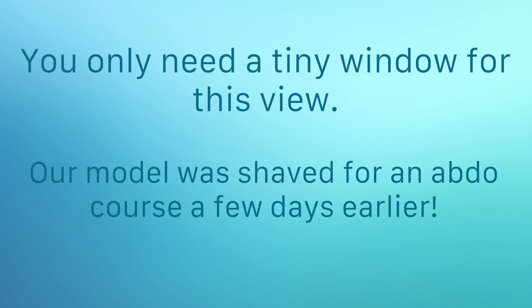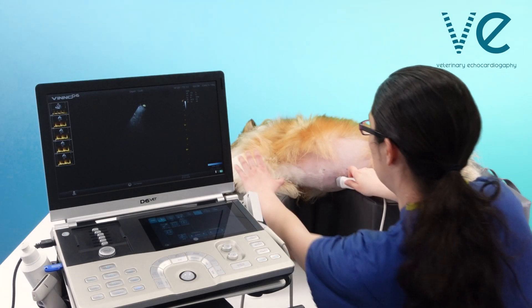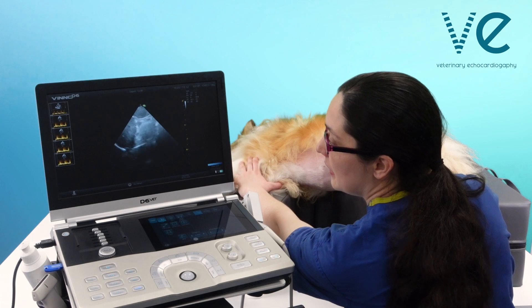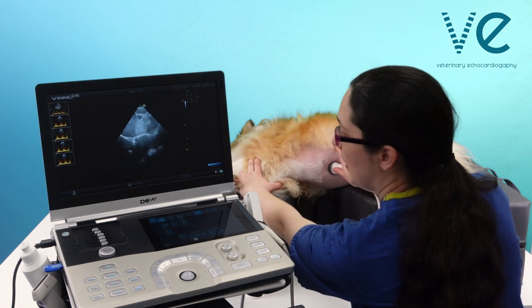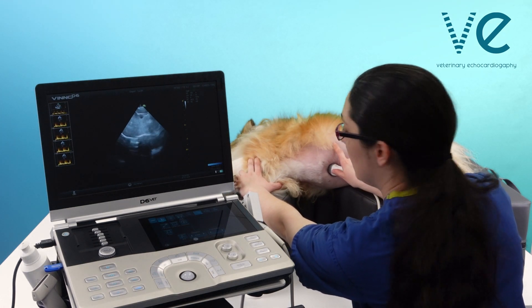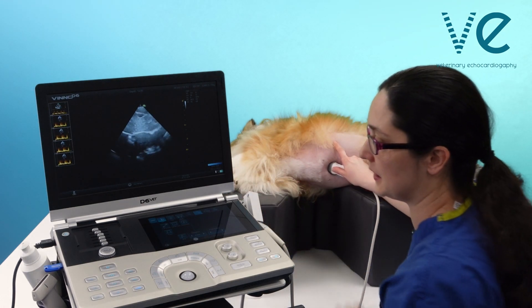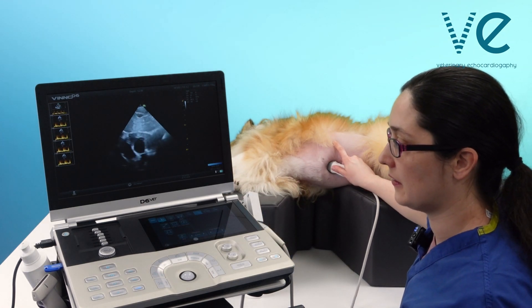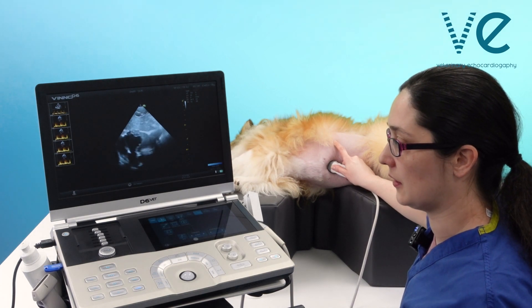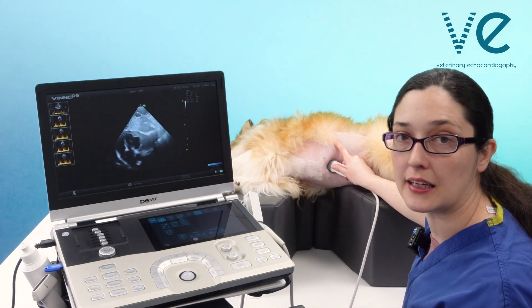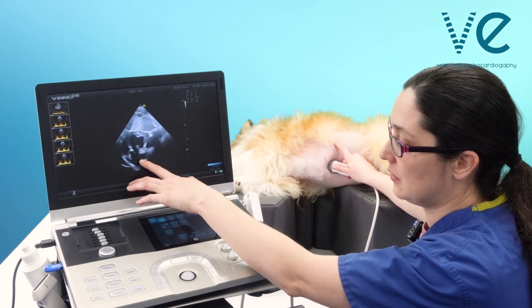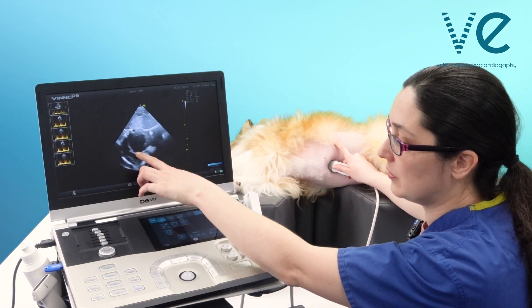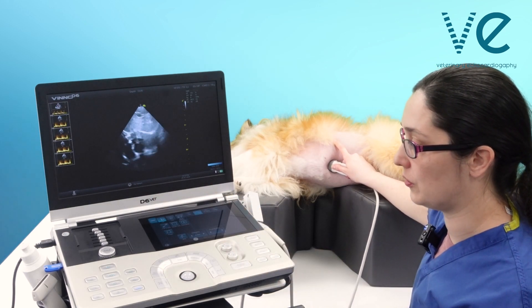To get your subcostal view, put the probe into the abdomen here. You have to press with a little bit of pressure and you're going to get the heart. So what you want really is to get the outflow tracts.